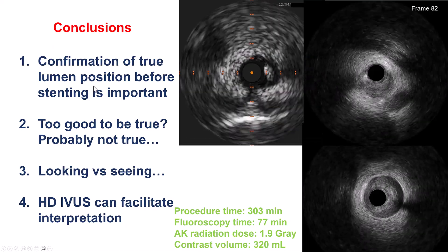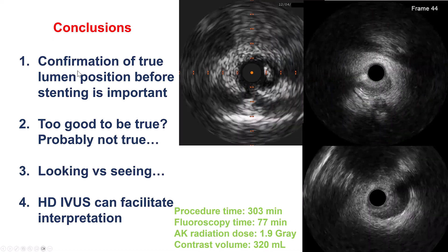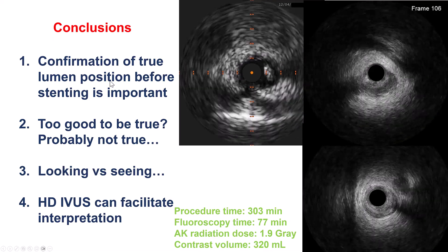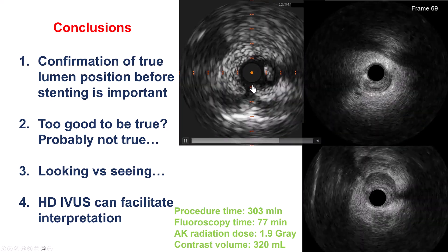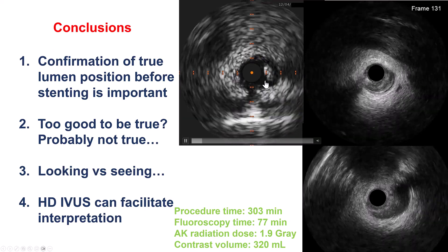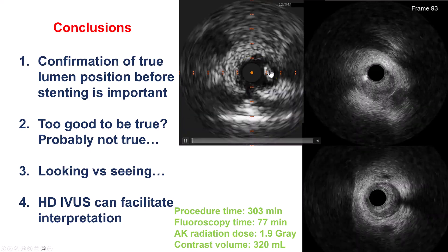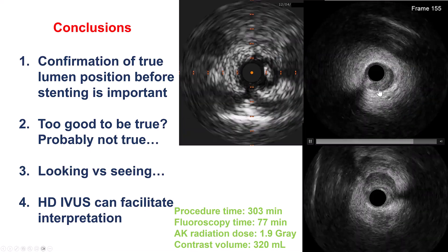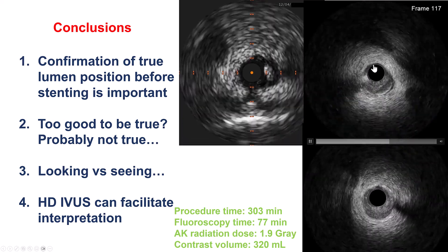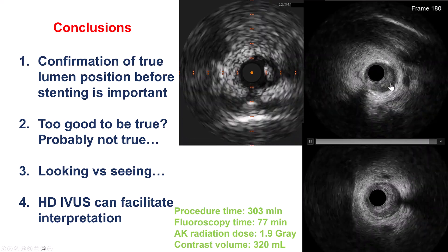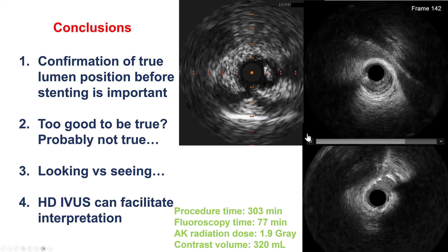Several lessons from this case. The first is evident for every CTO case: before placing stents, one needs to confirm that the guide wire is in the distal true lumen. One way to confirm is by using intravascular ultrasound. In this case, we thought the IVUS showed something on the wall, but it did not. This is apparent after we did the HD IVUS — 20 MHz versus 60 MHz — where we can now see much more clearly that we were in the false lumen, with the true lumen compressed on the bottom of the vessel.